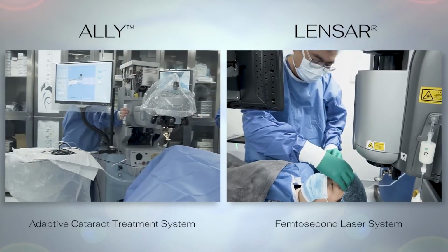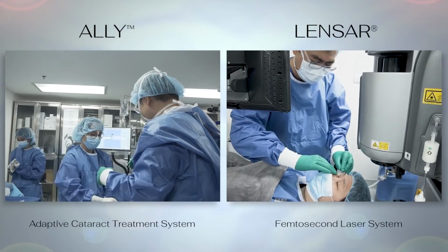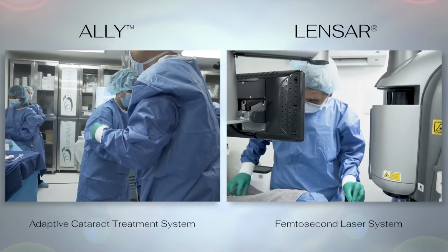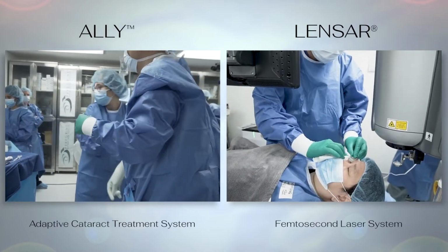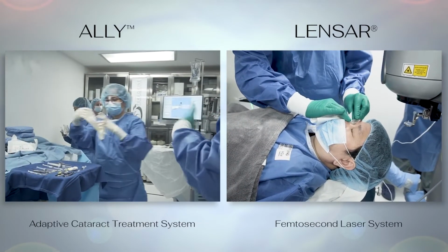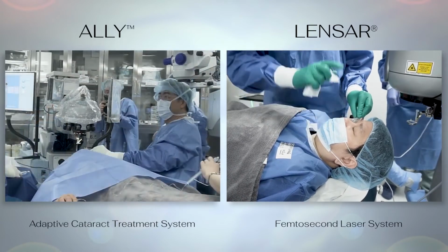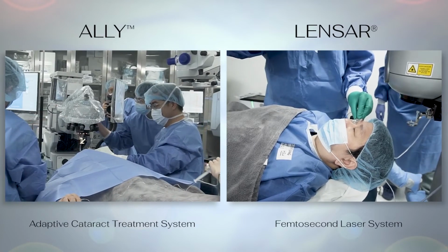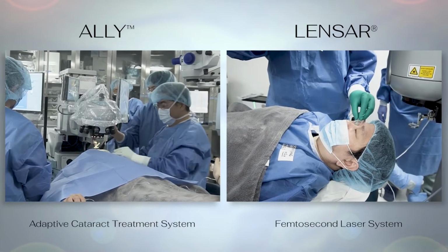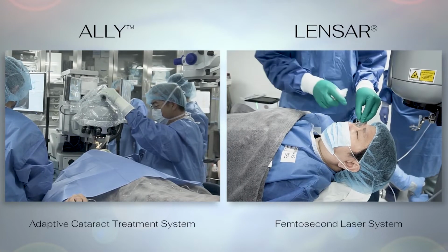So when you come into the room, the surgeon then gowns and puts on sterile gloves. Whereas with the original laser system, we're doing this in a non-sterile fashion. So you can see here that at this point, we're a little bit ahead in this real-time comparison because we don't have to put on the gown and the gloves. So we're already starting to do the docking. So we're a little ahead with the original LENSAR system.